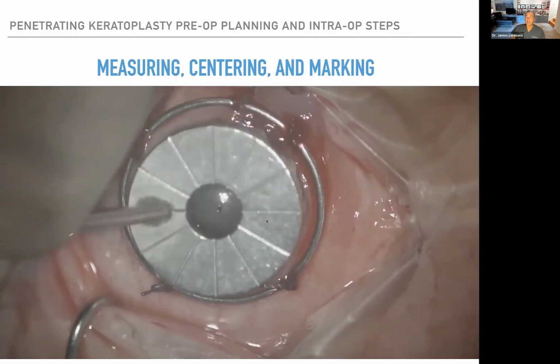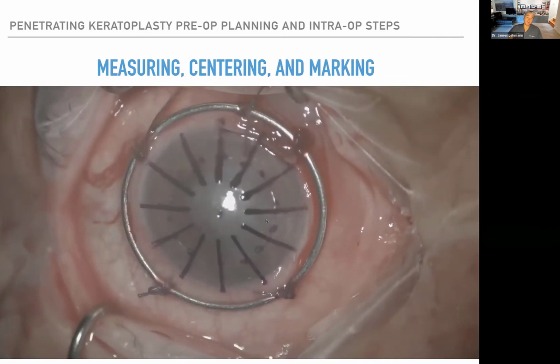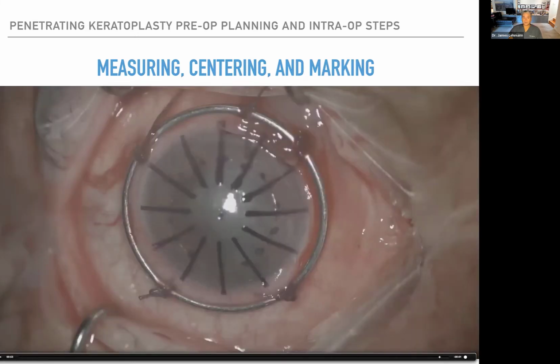It allows you to see all the dots that are encompassed. Now this is an RK marker, and that also helps to be able to place the suture. So let's walk through this frozen image again. I'm going to go back right there. All right, now here's the thing.